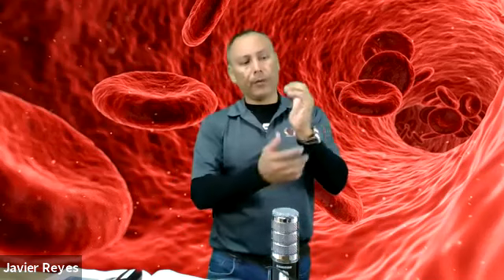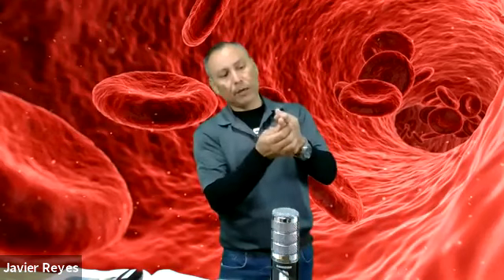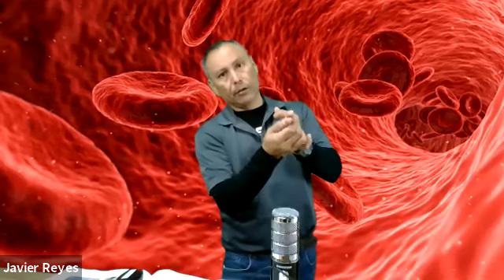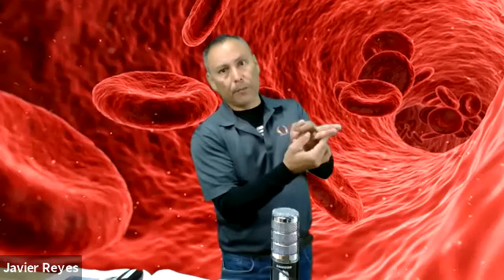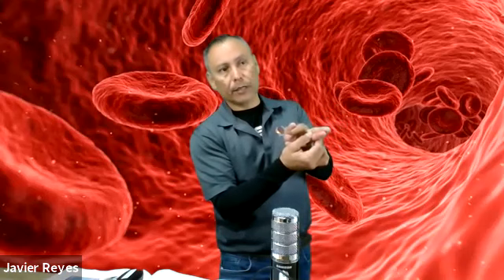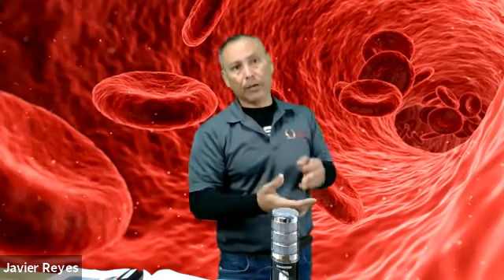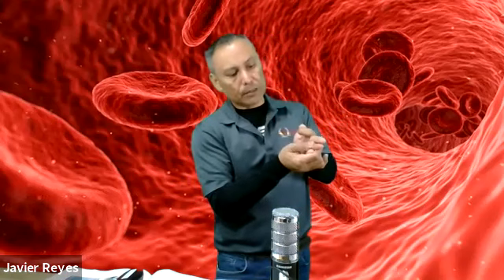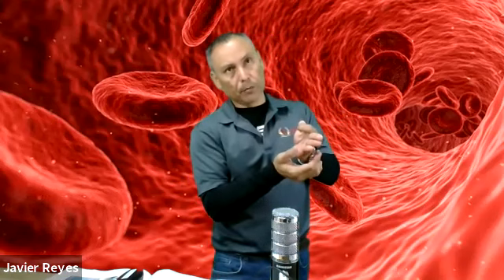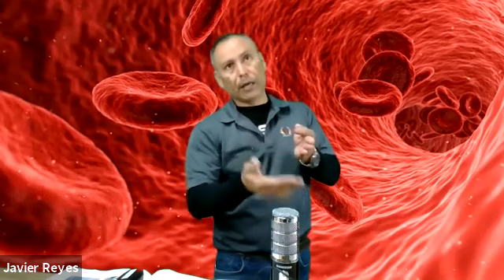Always remember, never milk the fingers or the sites. Sometimes you see a lot of people do this. You do not want to milk. Why? Because you're pushing intra and extracellular fluid into your sample, and you're contaminating your sample. It's going to be perhaps even rejected. So make sure that you don't milk the finger. Just press and release. Let the finger fill with blood again. Press, get your sample and release, and keep that motion going.